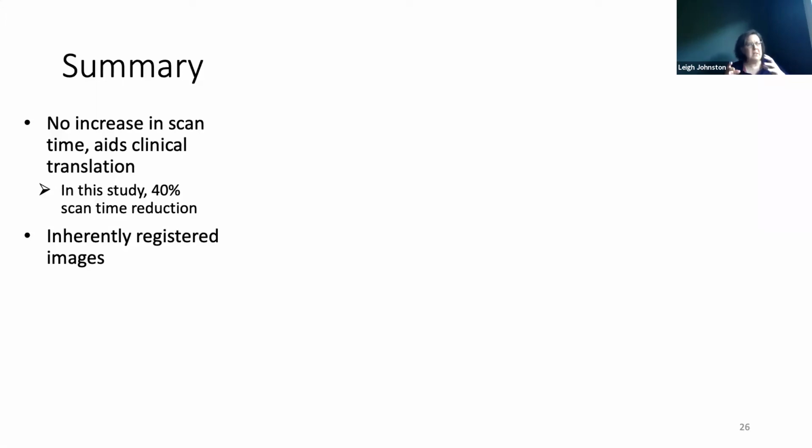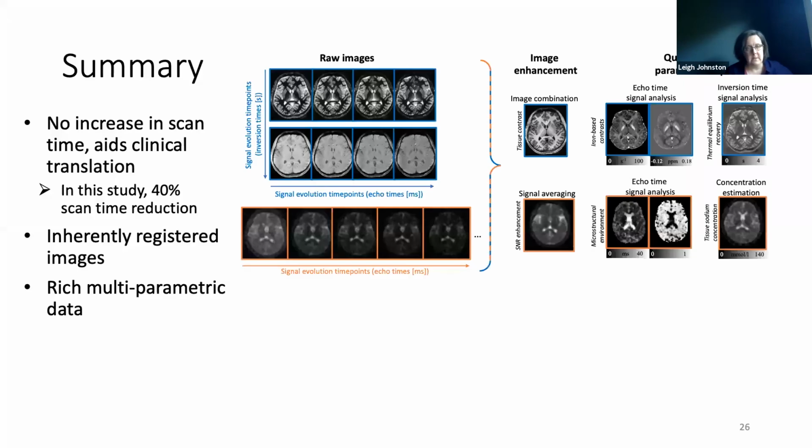And so we're always going through this process of, well, here's what we scan now, and here 3 seconds later for this functional MRI scan, we've got to register these two brains together to make sure that they're in the same space. This is also a great advantage of what we've done here, is that our images are registered together. So even if you take them in different resolutions, they overlay each other very, very nicely.